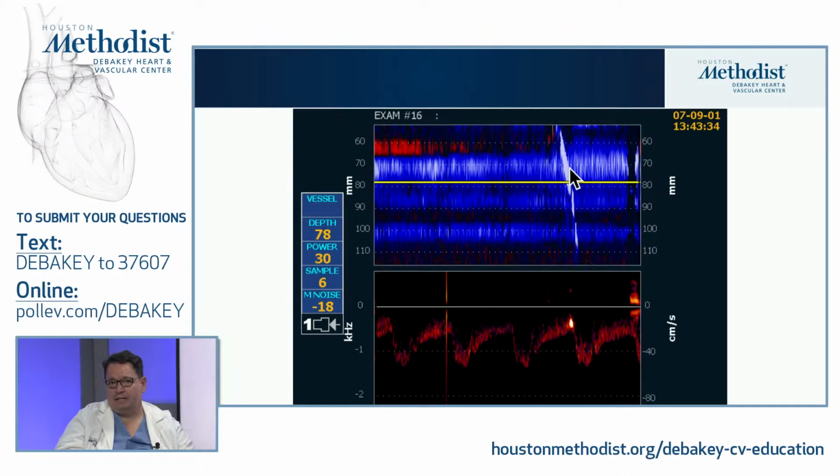Almost looks like that from the end diastole gets into the systole because this has become so much faster. So this is, I would say, really fascinating how it's jumping over. Looks like there's no border, no filter between the two heartbeats. So definitely one of these emboli can get from the end diastolic to the systole easily.